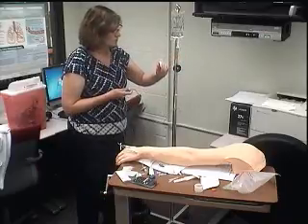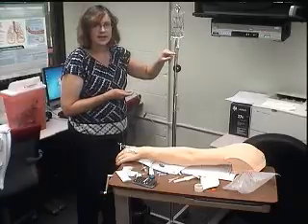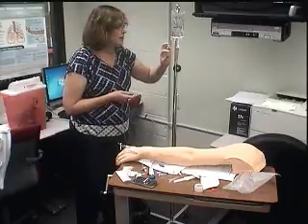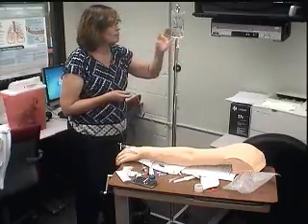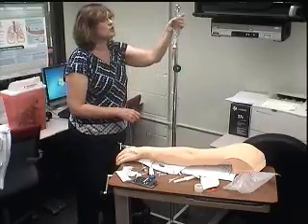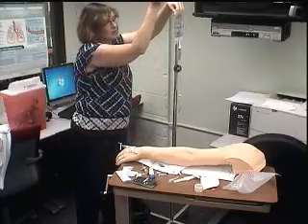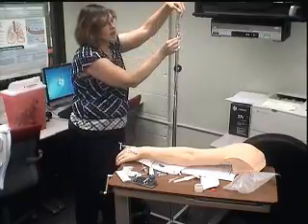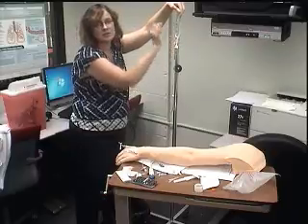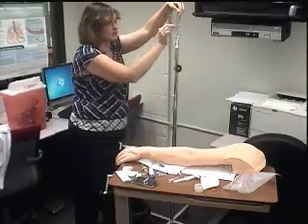So I would count 3, watch it drop 3 times in the 15 seconds. Now I know that I need around 12 drops per minute. So after I get the 3 per 15 seconds, I go back over that minute and get the 12 drops per minute. And of course, if you do gravity, usually you have a little tick mark thing, a little time tape where it says it should be at this time, this at this time, and so on. We time it with a little piece of tape that will tell the times it's at.